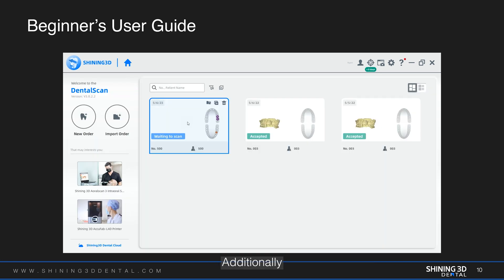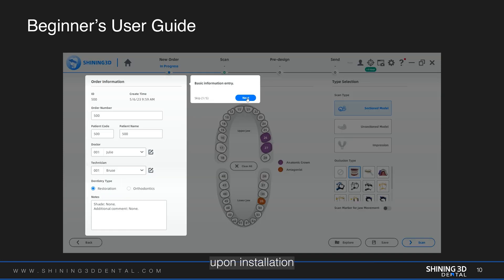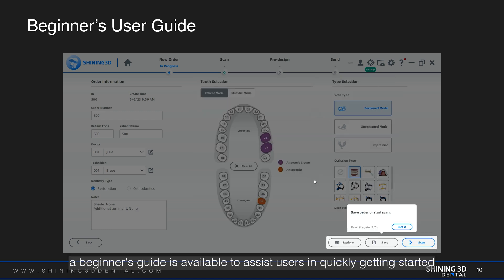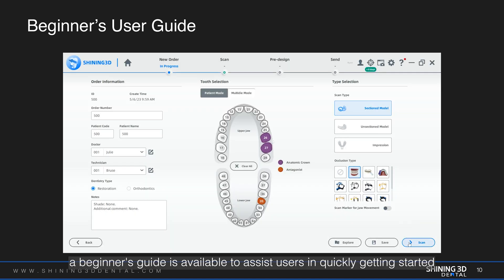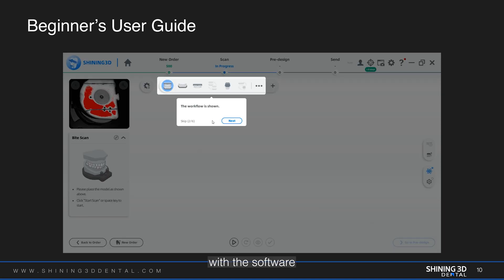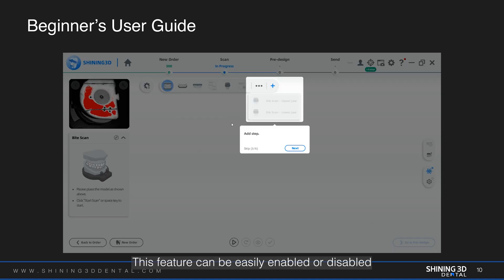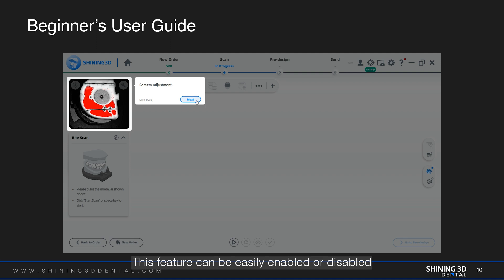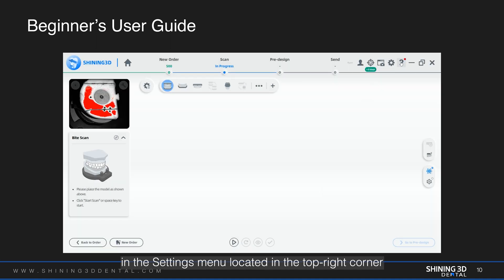Additionally, upon installation, a beginner's guide is available to assist users in quickly getting started with the software. This feature can be easily enabled or disabled in the settings menu located in the top right corner.